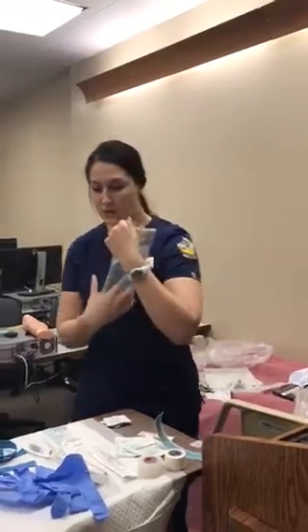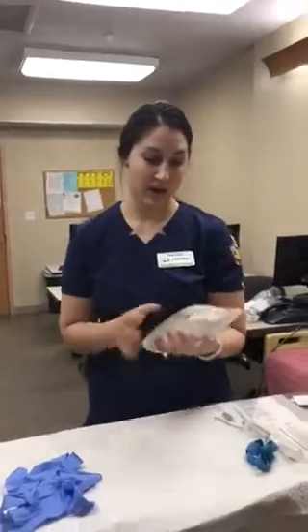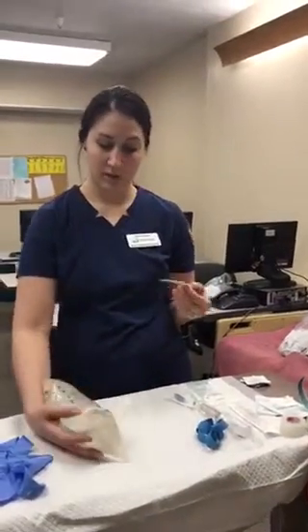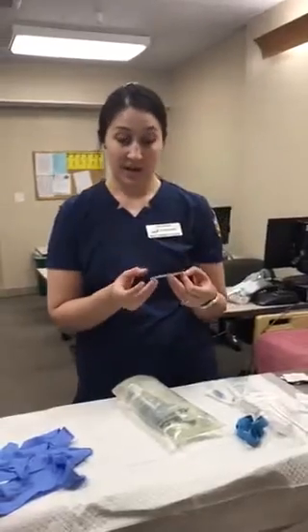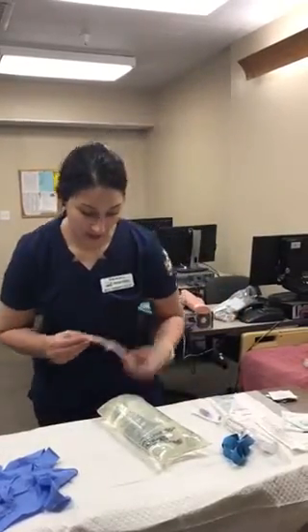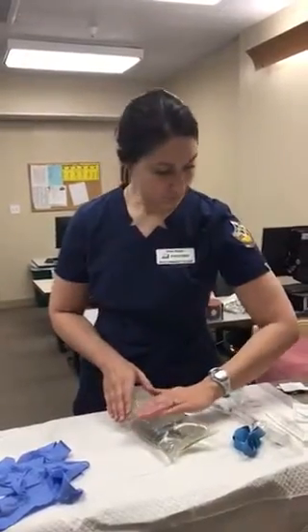So the first thing I'm going to do is label. I have already pre-made a label. And I'm going to label the bag on the back side of the bag so it doesn't interfere with any of the graduation on the front. I'm going to label it with the start date of the infusion, which is the 1300, and then my discard time, or my end time of infusion, and as well as my initials. So I'm going to go ahead and apply that to the bag.